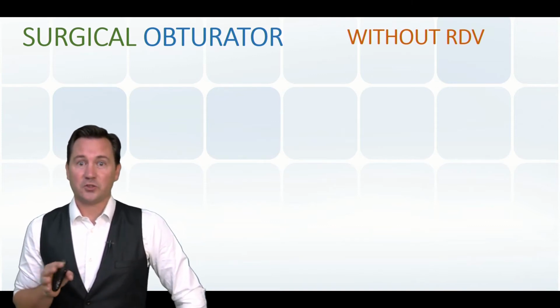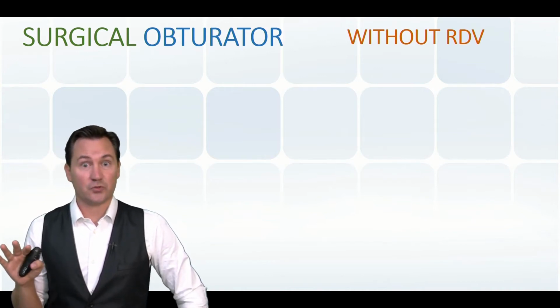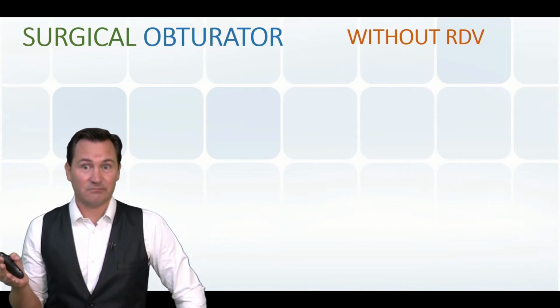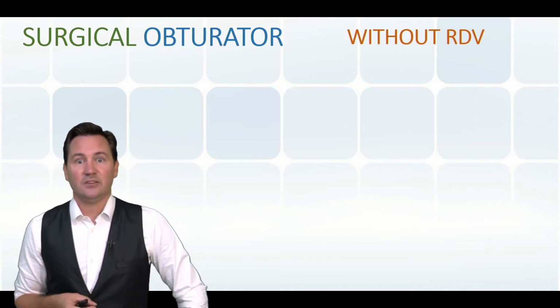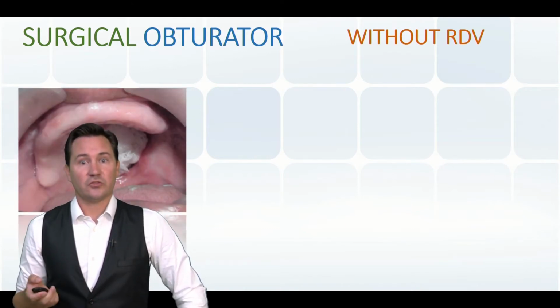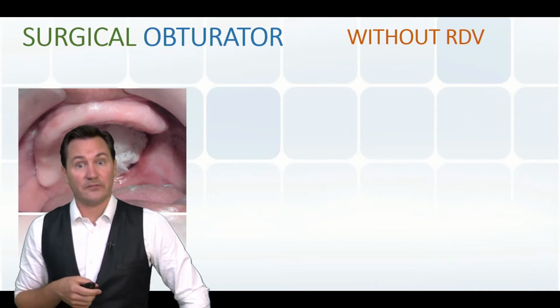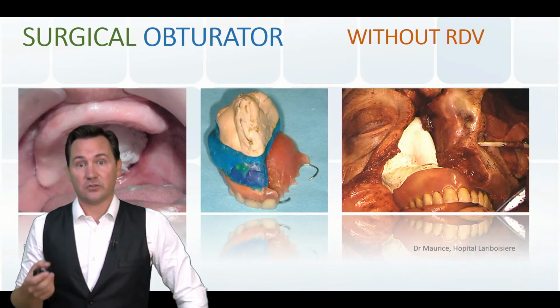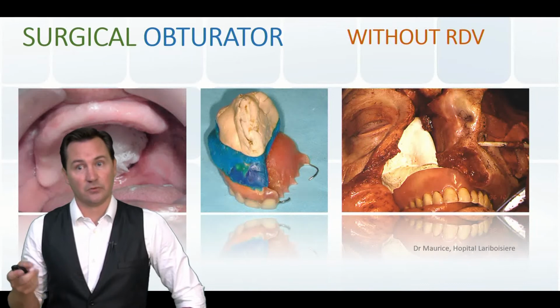The simplest obturators are those done without any dental consultation prior to surgery. Could be due to surgical emergency or to the absence of a prosthodontist. So we'll find gauze retained with wires, could be a ball of high viscosity VPS, or it could be the current prosthesis, either with silicone or retarded setting resin.